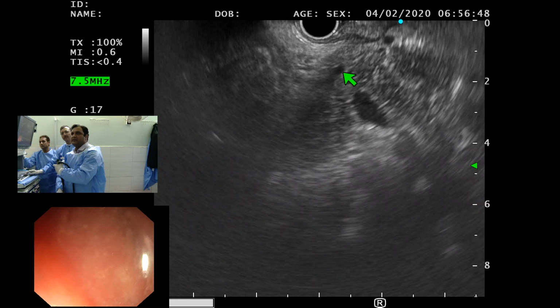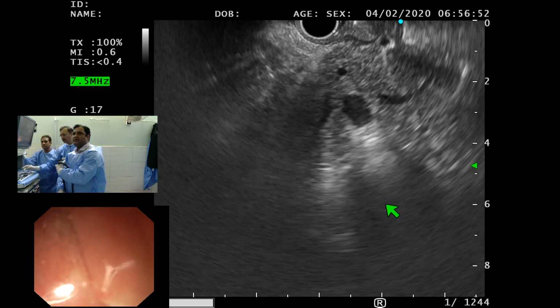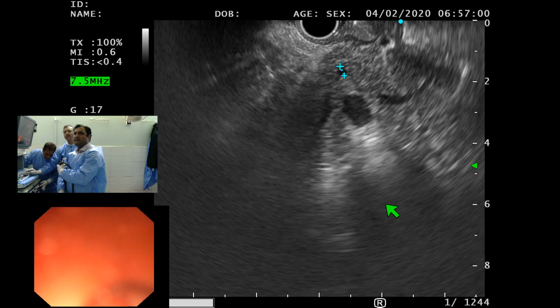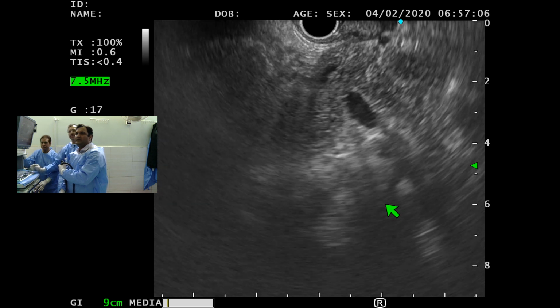This is the PD. Okay, let's measure this. 3.3, slightly upper limit of normal.